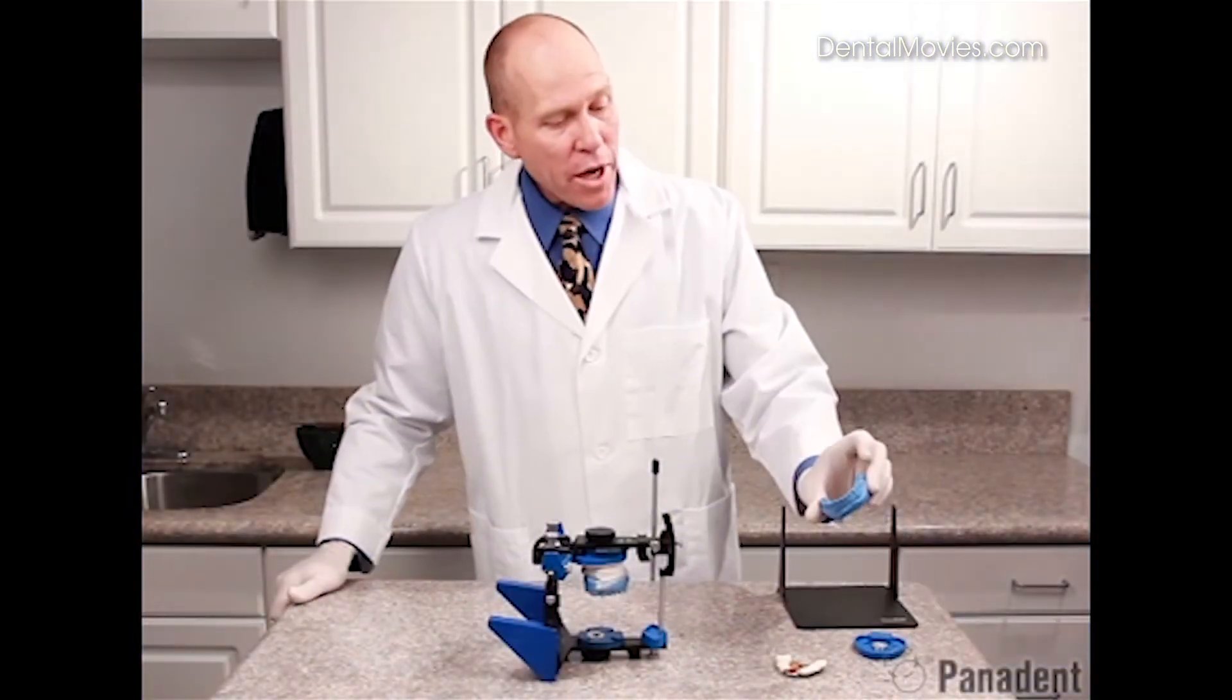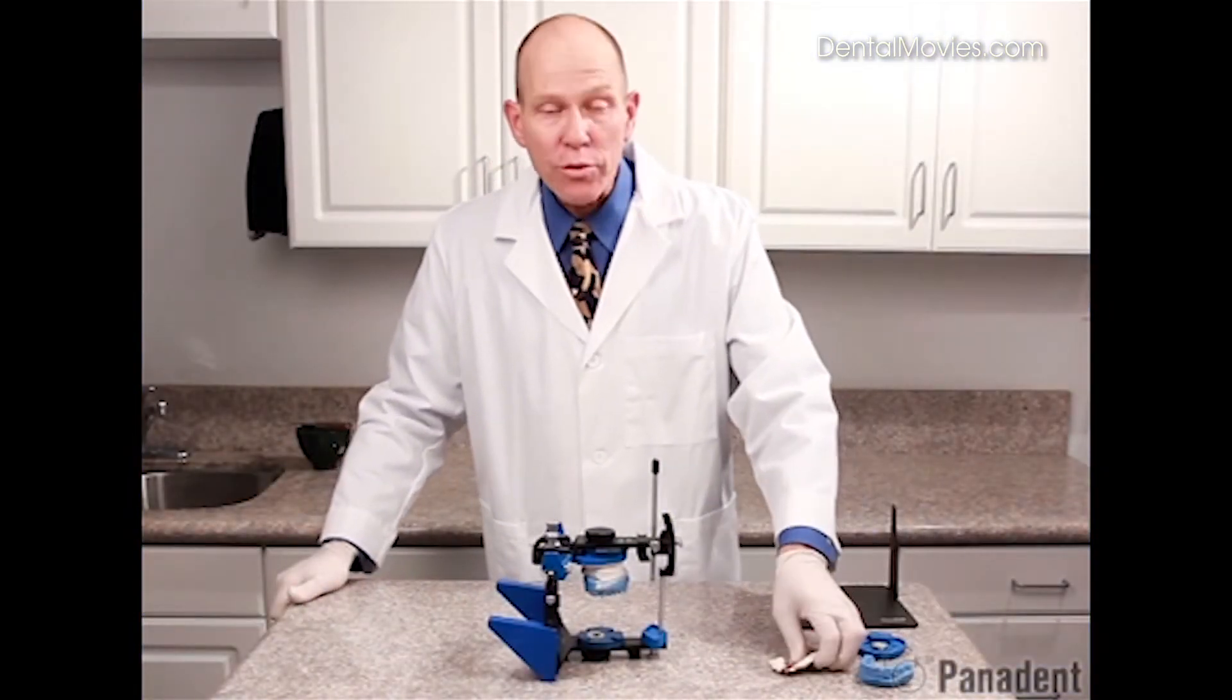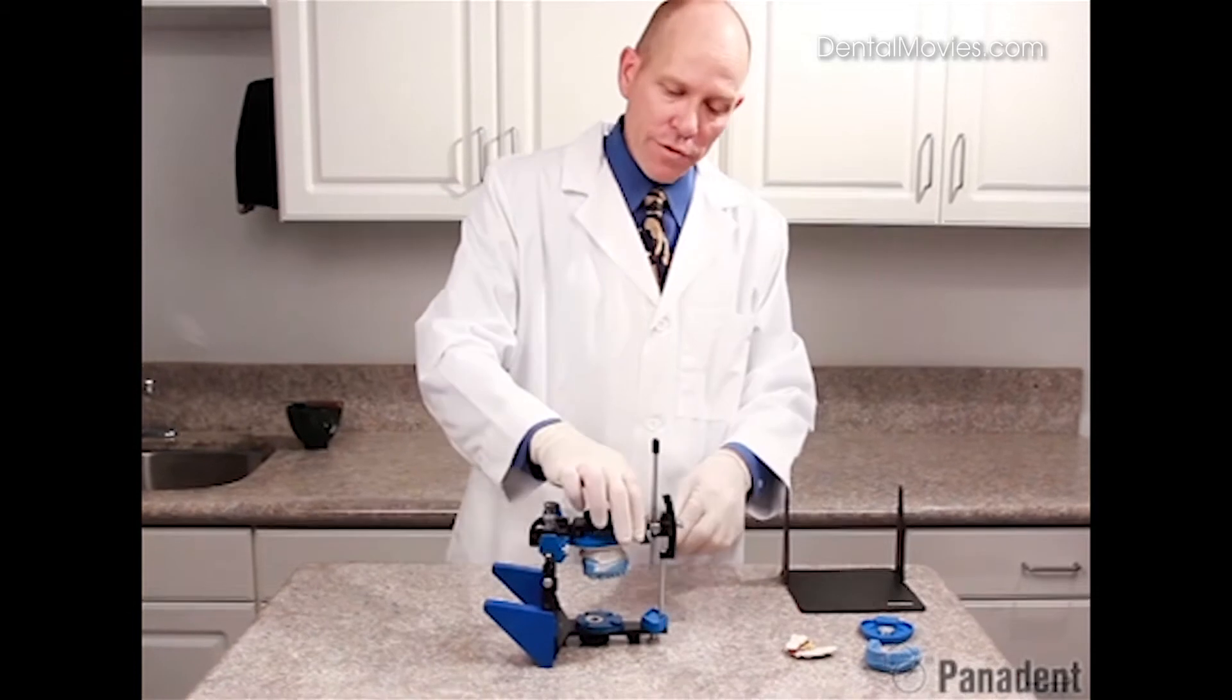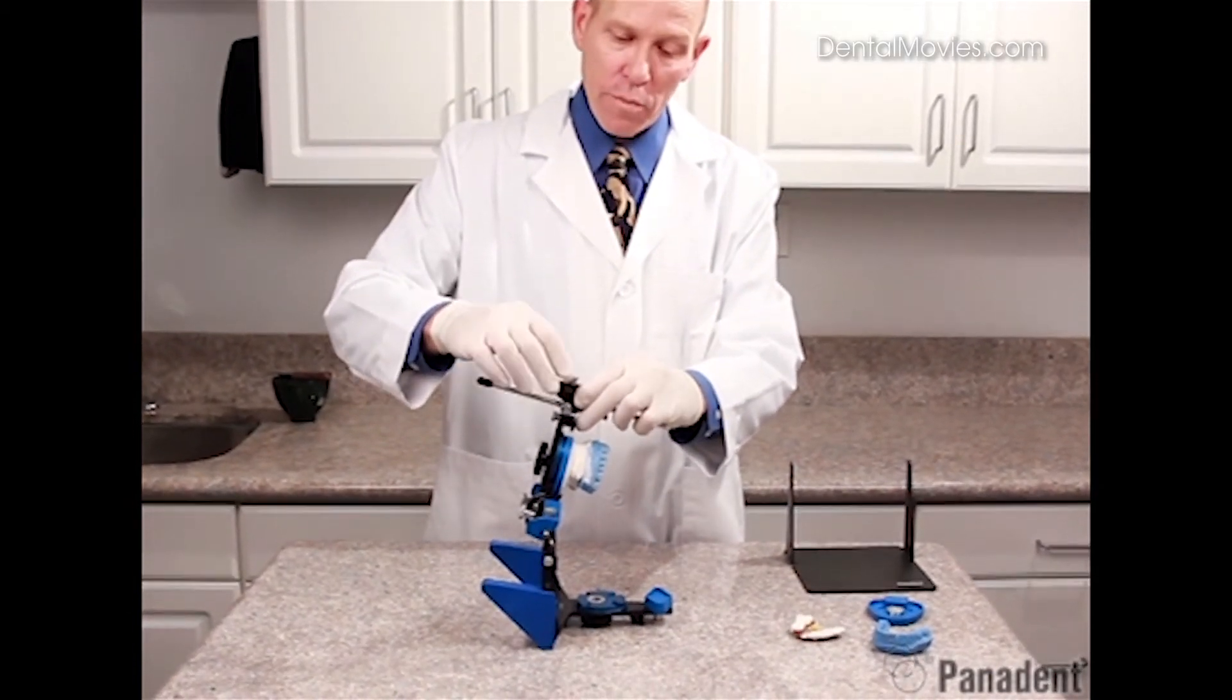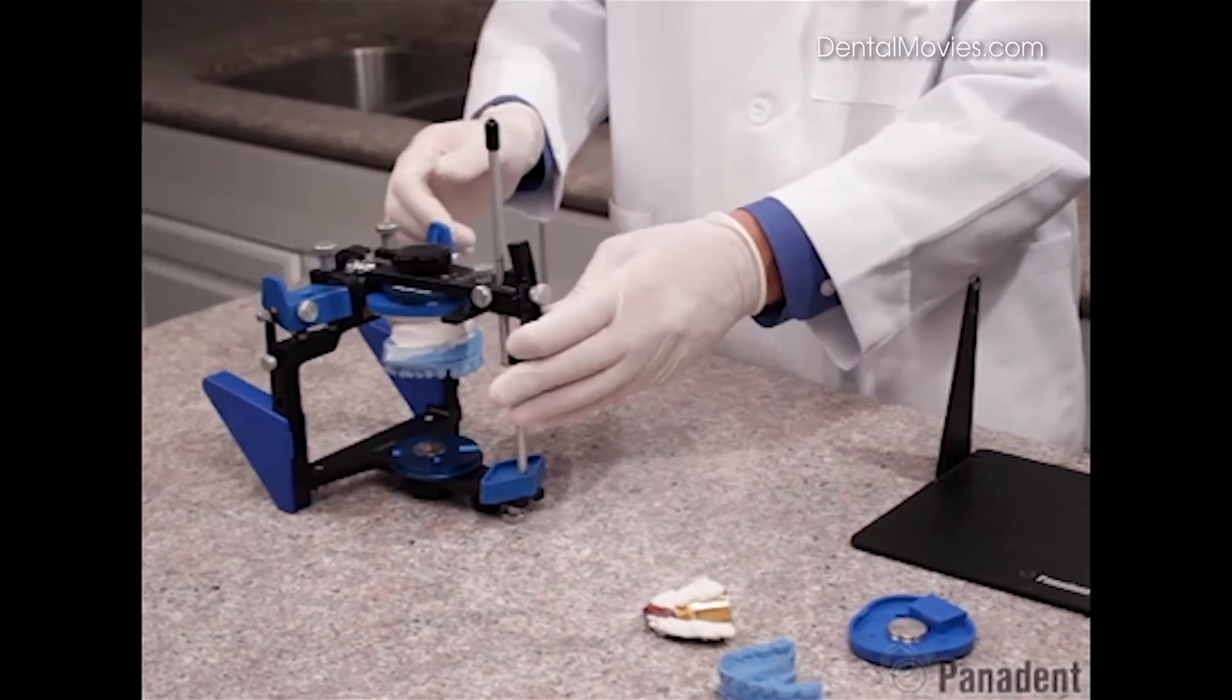We're now in the laboratory getting ready to mount our mandibular casts using our centric relation record. In preparation for that, we do want to adjust our incisal pin down about three millimeters, the approximate thickness of that interocclusal record.